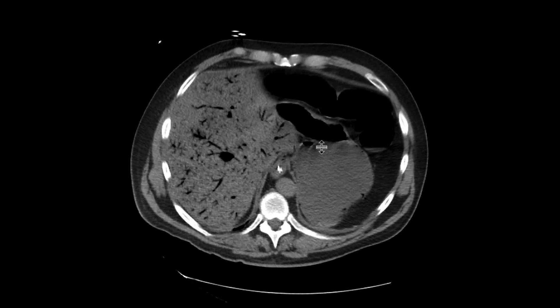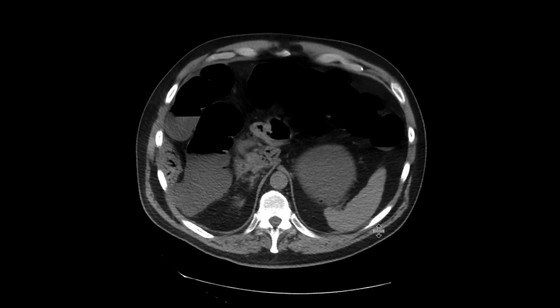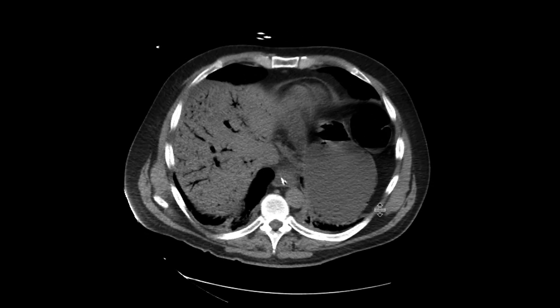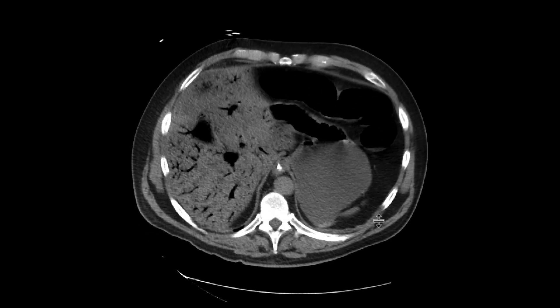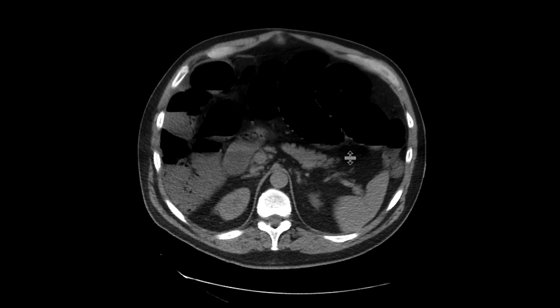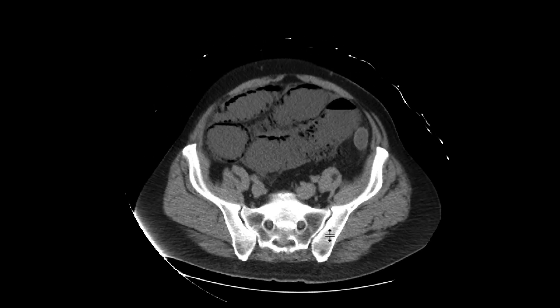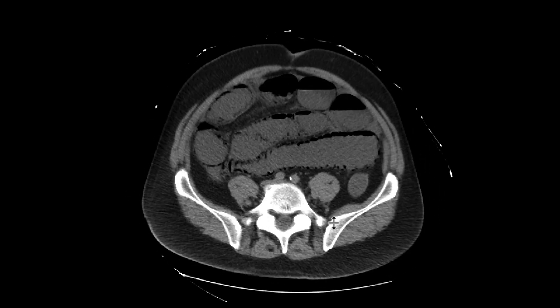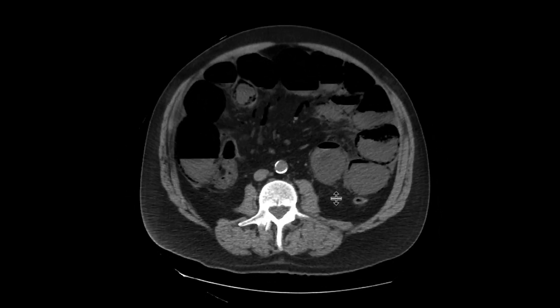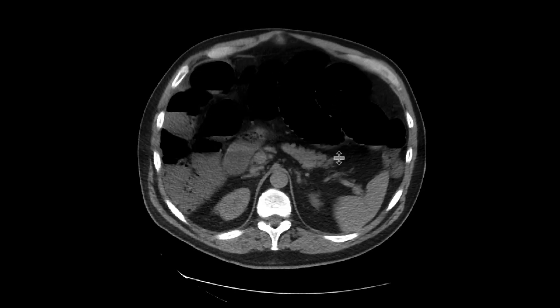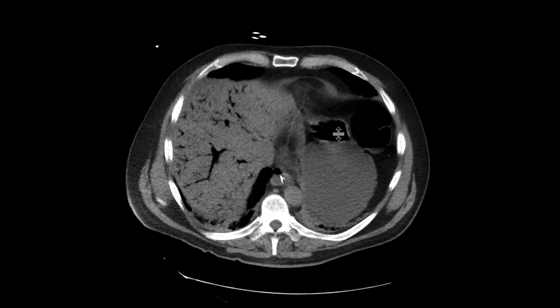We can also see some pneumatosis on the more subtle side within the stomach and the gastric wall over there. So extensive bowel ischemia with portal venous gas in this patient. The patient ended up going to the operating room, and much of this bowel was resected as it was ischemic and infarcted.